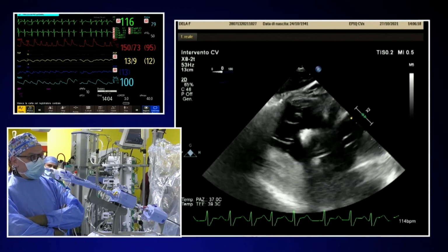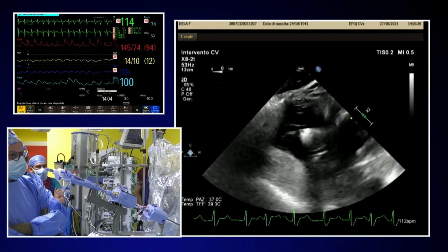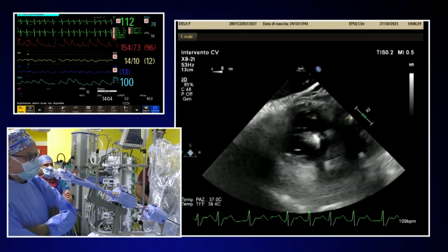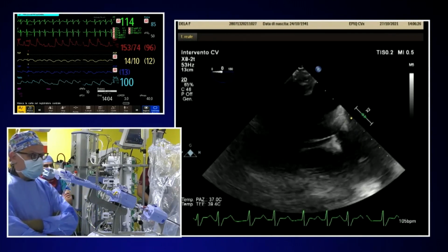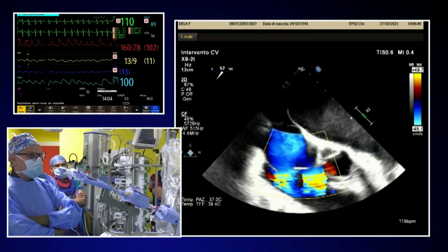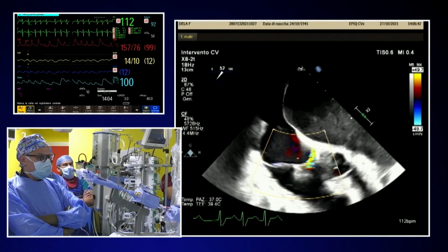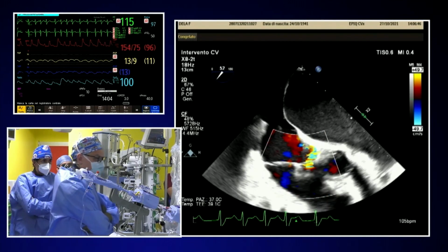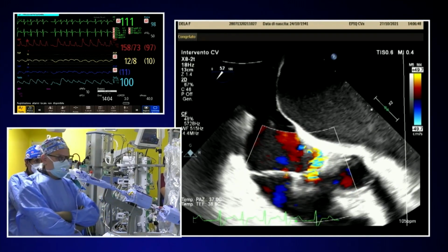I do it only if Eustachio tells me that the vena contracta is above 3 millimeters. So I give him a number. If there is still a moderate TR coming from there, probably we should address it. The other challenge, technically speaking, you see the septum is really in front of it.